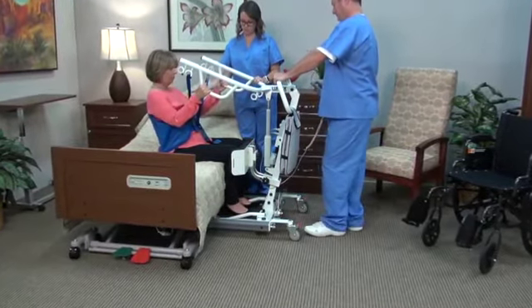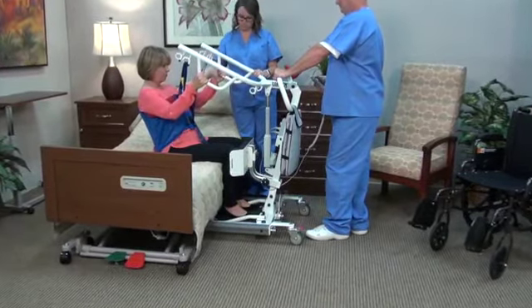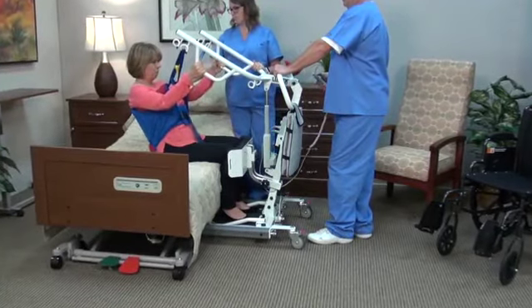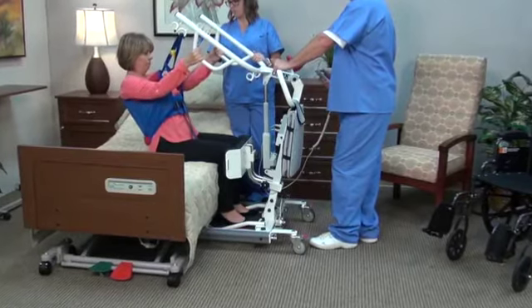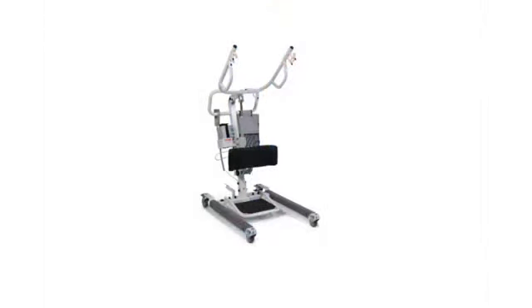A lift should always be used with two caregivers and only used for transferring a resident from one object to another. It should not be used for transporting or moving a resident from one location to another. Do not attempt any transfer without prior approval of the resident's health care provider.